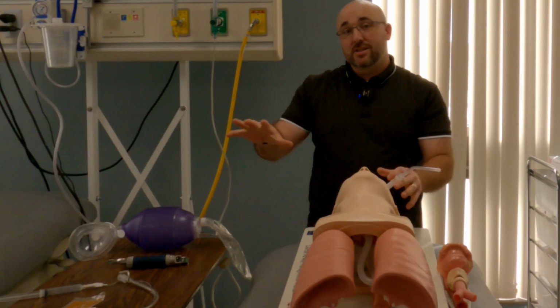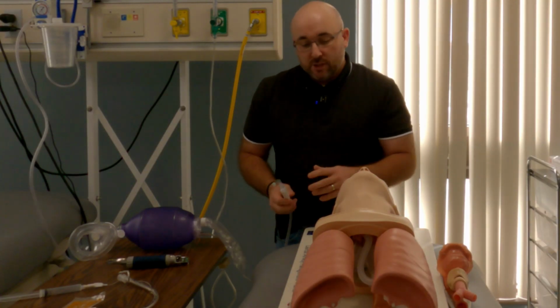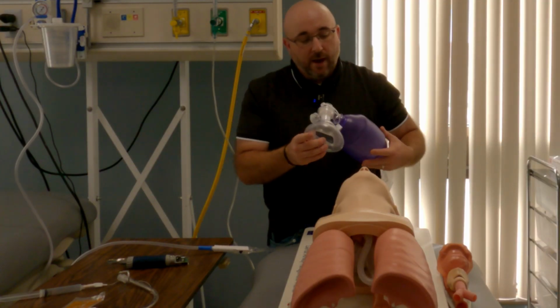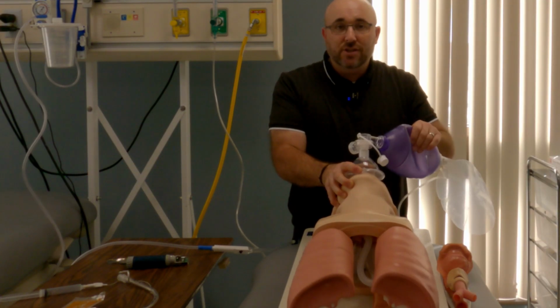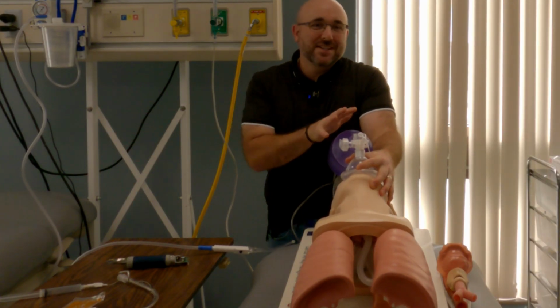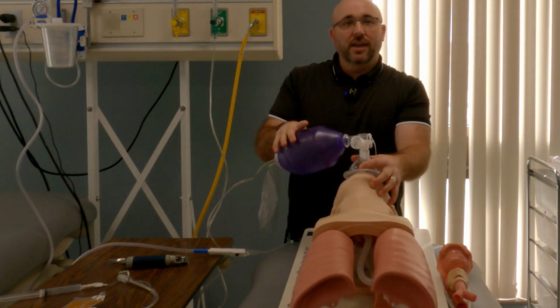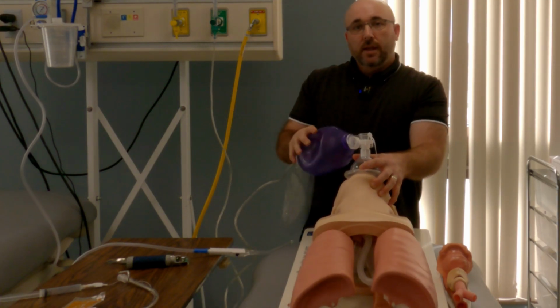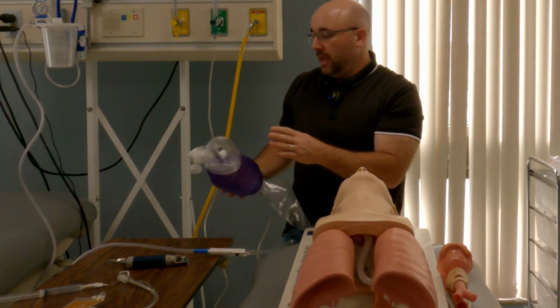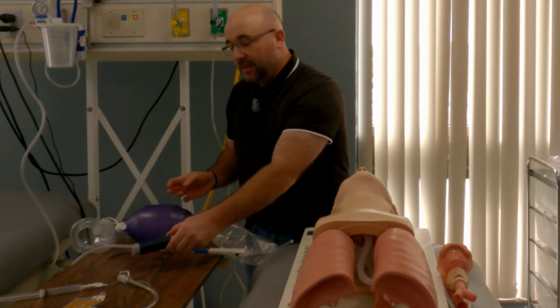Now remember, the assistant's always off to the right-hand side. So if I'm going to go in and I'm the person intubating, I'm going to have the suction down at this point. I may be doing some bag valve mask ventilation. I may use the assistance of my assistant on the side to be able to help secure this until we're ready to go. Now, once we're ready to go and the patient's sedated, we're going to go in and I'm going to set this down.